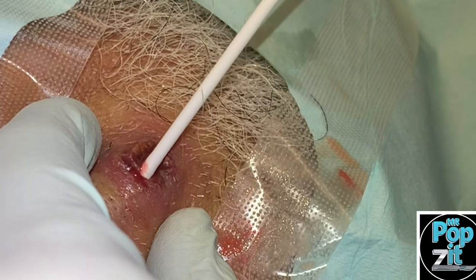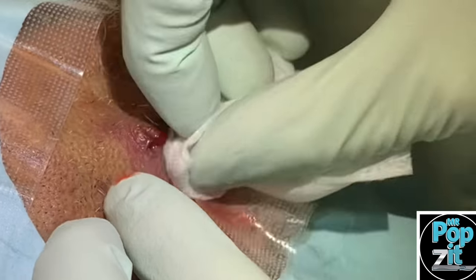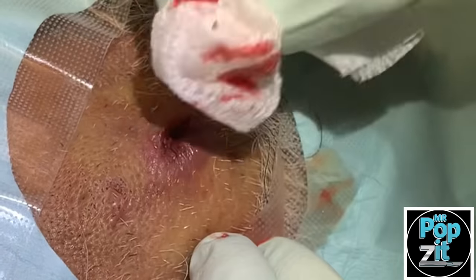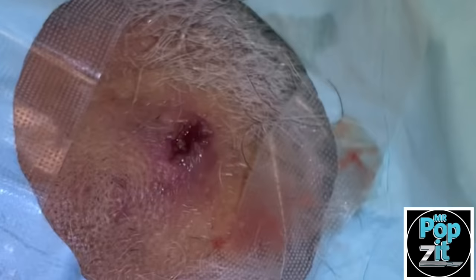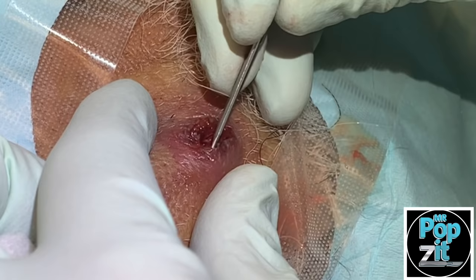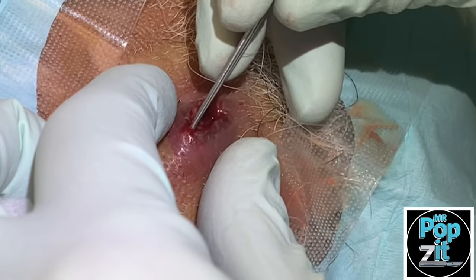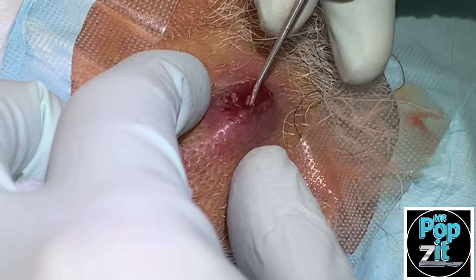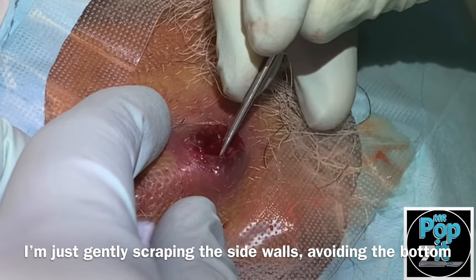Deep in the pocket there — no pain? Good. Now what we can have sometimes in there is loculations, which are kind of little pockets of pus, and you can use multiple things. All you need is something blunt. We reach in here a little — let me know if any pain at all. Just a little? Yeah, it's hard to get that deep pocket numb because of the acid-base shift, so I'm not going to push around much here. The base of this can be very sensitive.